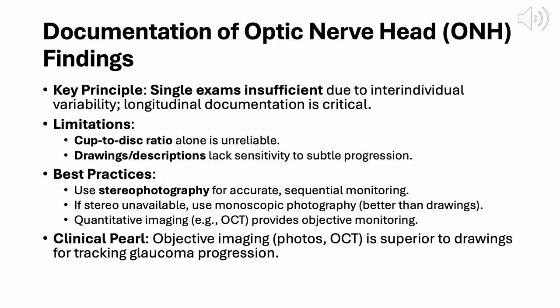It can vary widely between observers and even within the same patient, depending on lighting or dilation status. Additionally, drawings and written descriptions often miss subtle but clinically important changes over time. Instead, we rely on best practices for documentation. Stereophotography is the gold standard for accurate sequential monitoring.